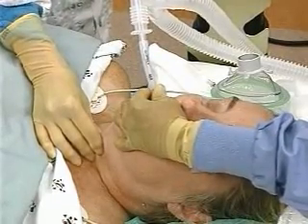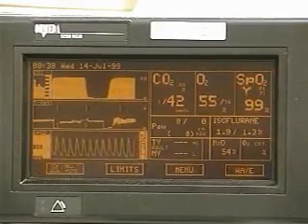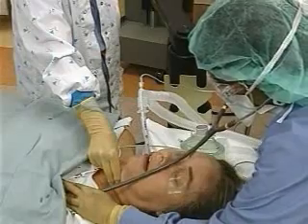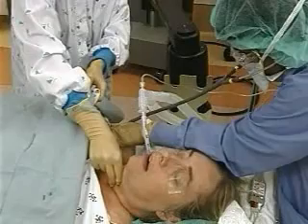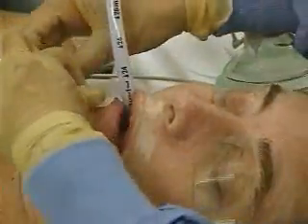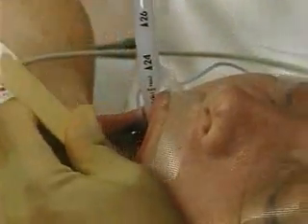Check a minimum of six breaths for measurement of CO2 on the CO2 monitor; this ensures that CO2 return to the breathing circuit has a pulmonary source and is not insufflated air from the stomach. Listen for bilateral breath sounds over the chest and for an absence of sounds over the gastric area. If all clinical signs confirm intubation of the trachea, the assistant may release the cricoid pressure. Tape the tube securely and carefully place a bite block in the awake patient to avoid obstruction from biting.